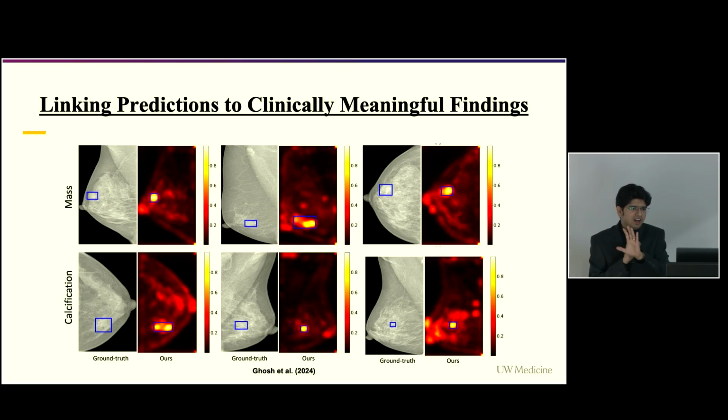And then we can go ahead and ask whether it is detecting the lesions well, whether it is identifying the type of lesion. For example, in the case of breast cancer screening, it would be very important to know whether the model's predictions corresponded to the detection of masses or calcifications, such that the radiologist can now think of the next steps. Do they need a focused diagnostic image? Do they need shorter screening intervals? What are the next steps that a radiologist can take to help the patient?